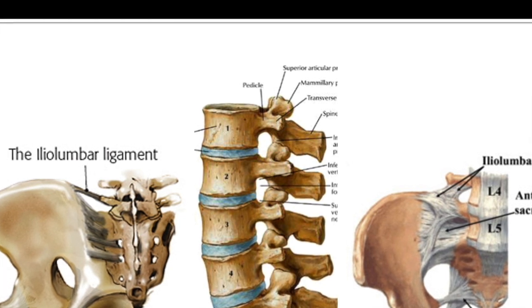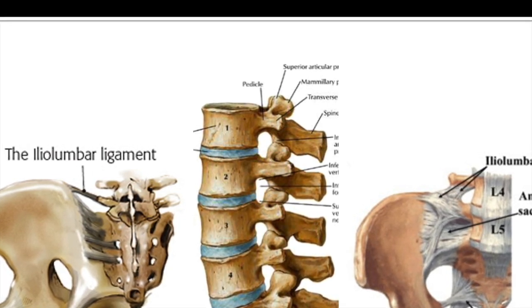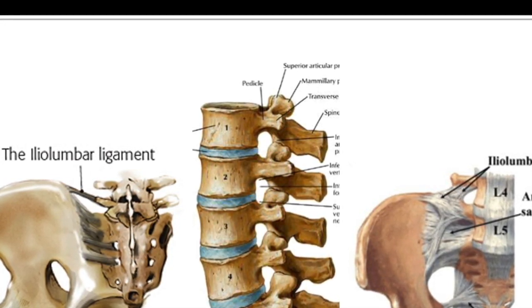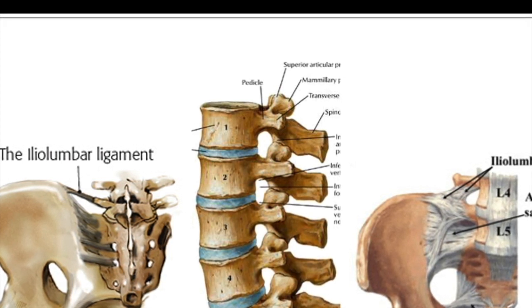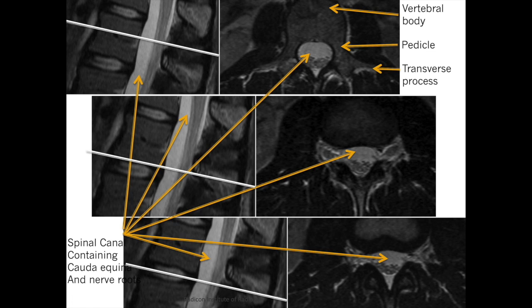This means that the L2 nerve root exits approximately at the mid-body of L2 and not at the level of the L2-L3 disc. At the middle slices, at the level of the lower end plate, the nerve root is already just outside the exit foramen, and a central disc herniation at this level is unlikely to cause nerve root impingement. However, a lateral or far lateral disc herniation at this level could still impinge this nerve root.